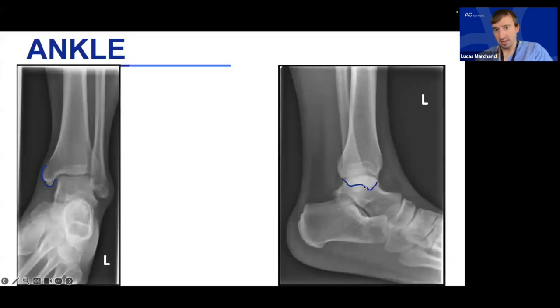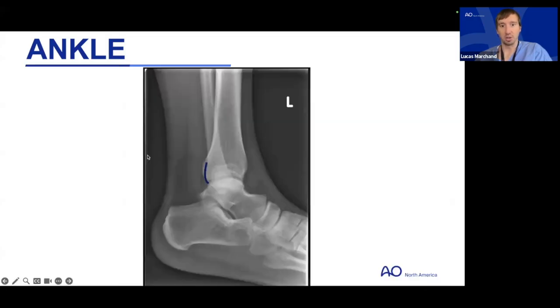And again, you can see a shadow of the medial malleolus on the lateral. It typically sits just proximal to that shadow of the fibula, which makes sense because if you look at the AP and the mortise views, the fibula extends more distal than the medial malleolus. So that shadow you see basically between the dome of the talus and the distal tip of the fibula is that of the medial malleolus, which typically has two colliculi, the anterior and posterior colliculi of the medial malleolus.